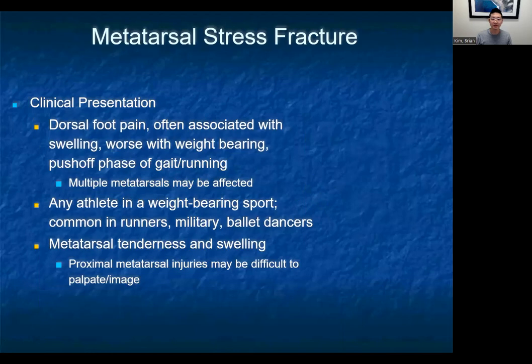Our next injuries are metatarsal stress fractures, which are also very common. Similar types of athletes are prone to these — runners, weight-bearing athletes, and military personnel. They'll present with dorsal foot pain, there may be some swelling, and multiple metatarsals may be affected or tender on clinical exam.